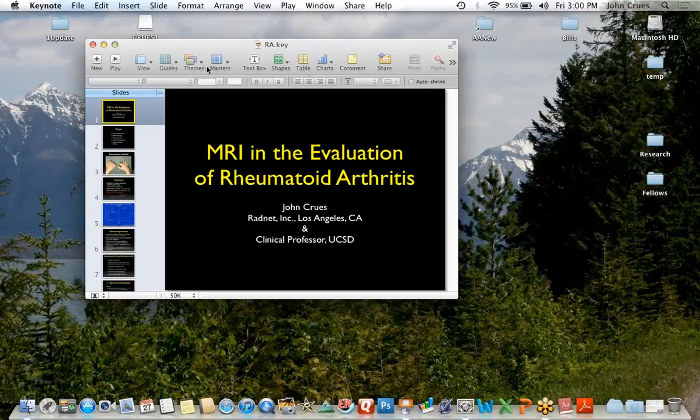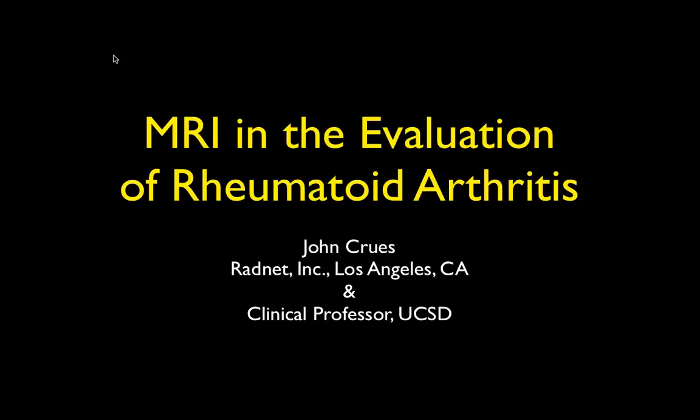And I'd like to take a little break here and talk more about a disease process. And then we'll come back in 2 weeks. When I come back 2 weeks from Monday, we'll talk about inflammatory disease of the knee. But first, I'd like to give a talk about how to evaluate inflammatory disease with MR.